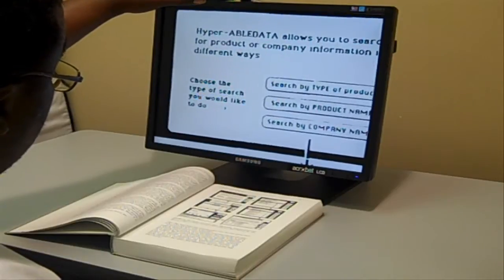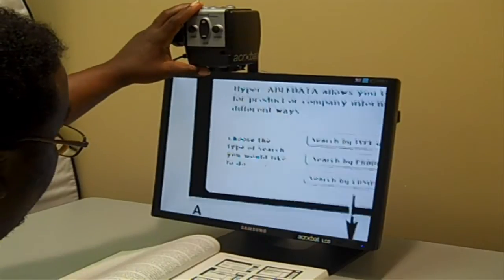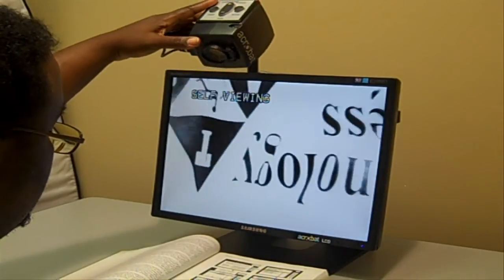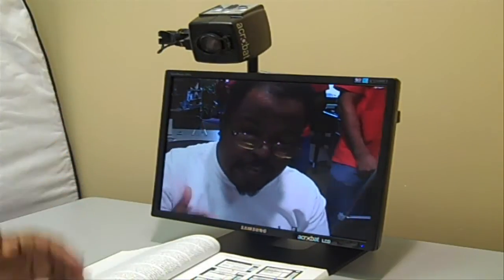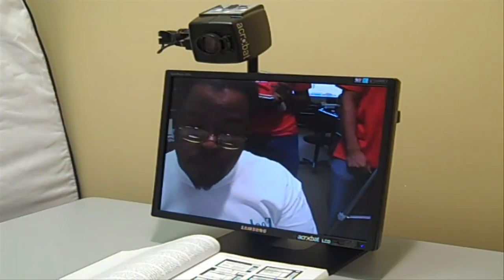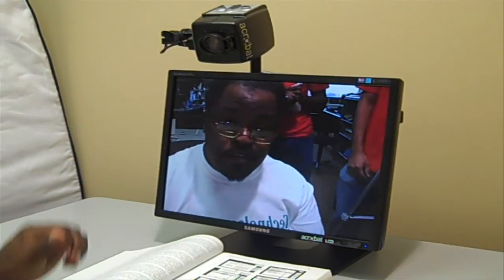Not only can the lens screen focus in on your book, you can also turn it towards yourself. For example, ladies can use this screen to do their makeup or fix their hair — you can focus it on yourself and look at yourself.